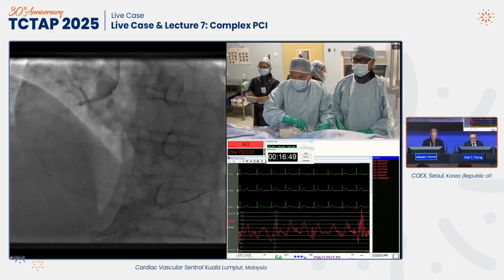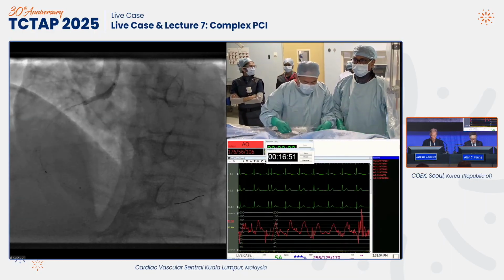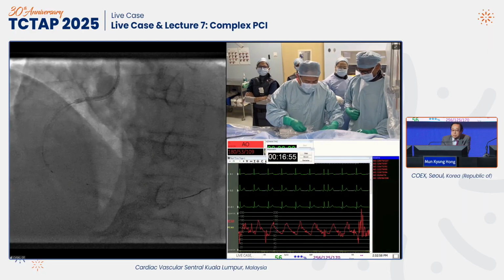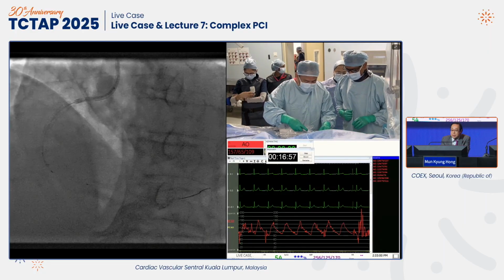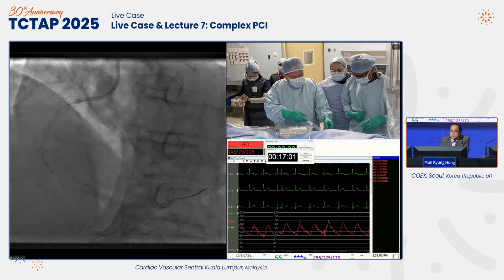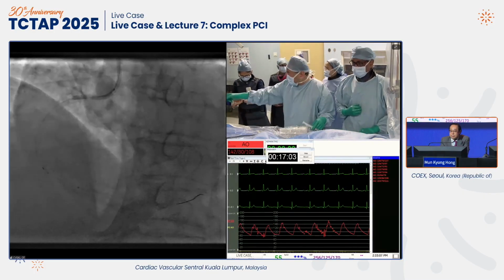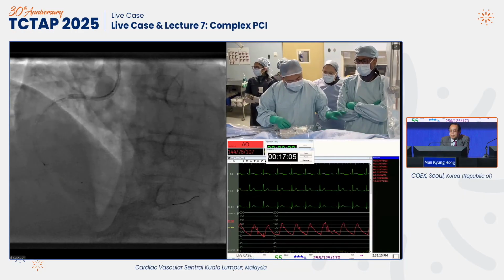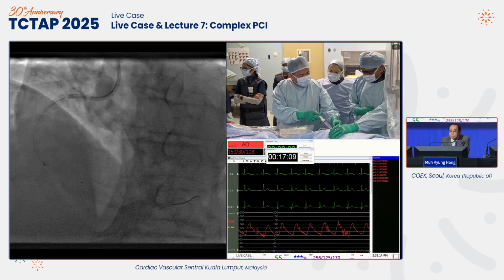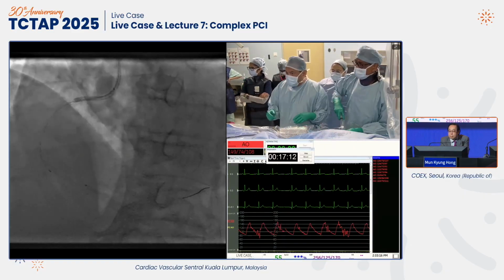Okay. I might have missed it, but besides the novelty, what are the theoretical advantages of the mechanical lithotripsy versus the conventional one? Did you mention it? Yeah, we did mention it. Number one, I think, is deliverability. Number two, most importantly, they come in different sizes.